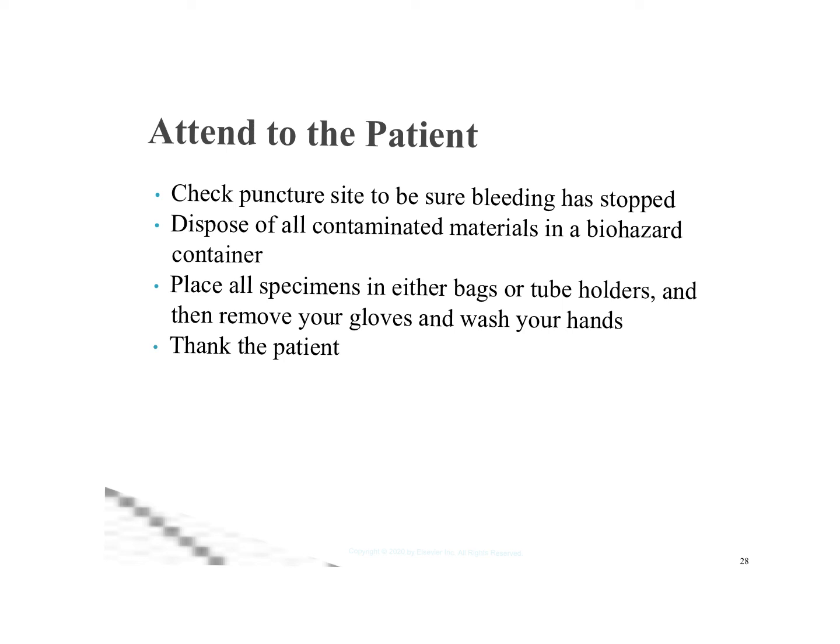Dispose of all contaminated materials in a biohazard container if your facility says. Most of that stuff, other than the needle stuff, can go in the regular trash. Place all of your specimens in either bags or tube holders, and then remove your gloves and wash your hands, and thank the patient.